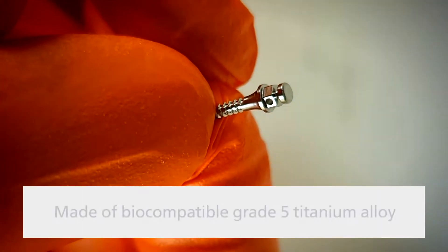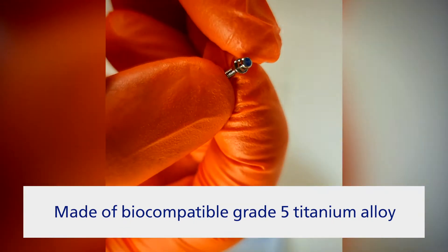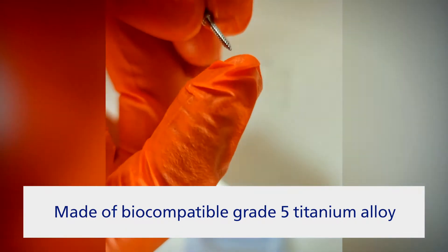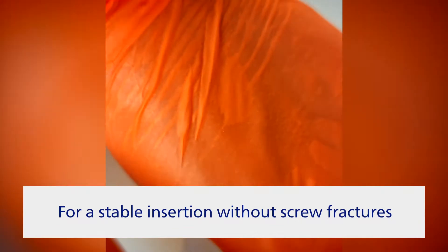Made of grade 5 titanium alloy — which is 90% titanium, 6% aluminum, and 4% vanadium — it is very strong, fracture-resistant, and biocompatible.